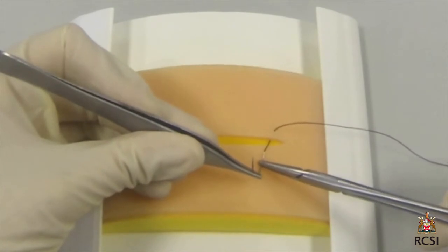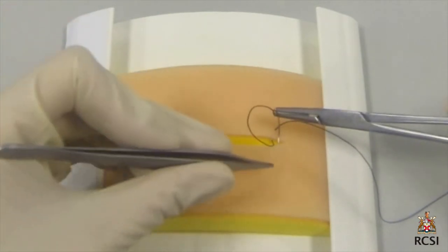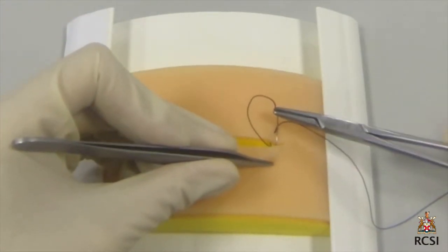In our first suture, the needle is brought out through the wound. The needle is remounted onto the needle holder and reinserted at the same depth on the other side to ensure symmetry.